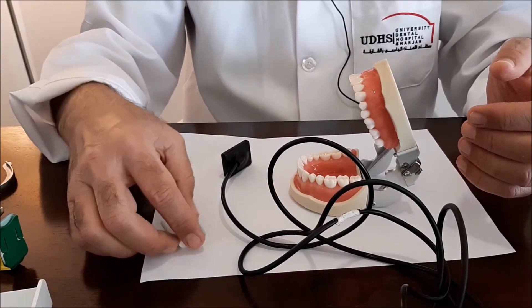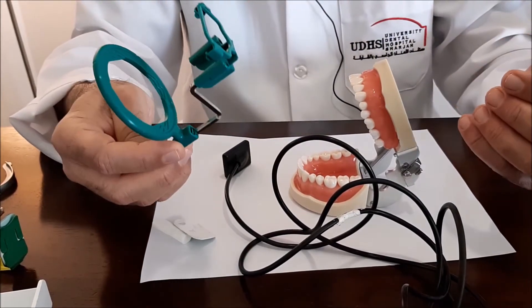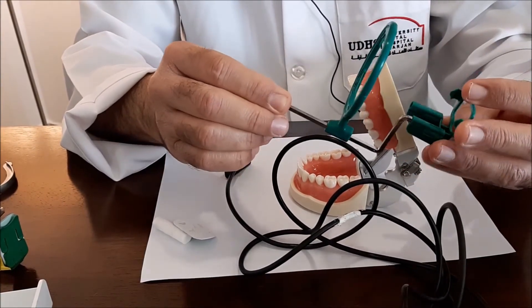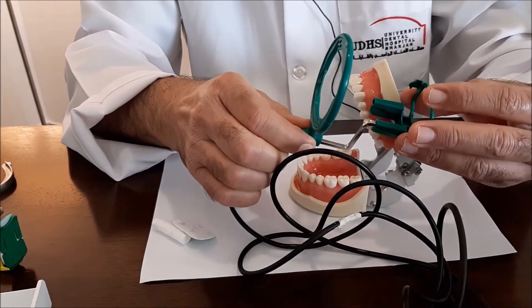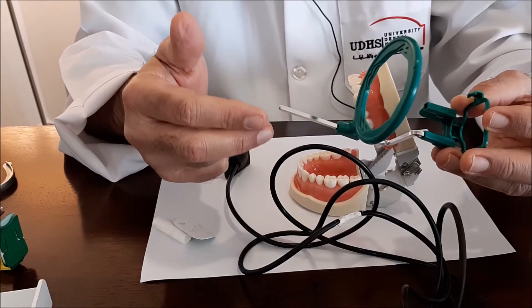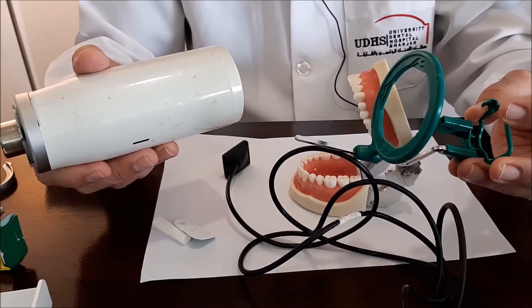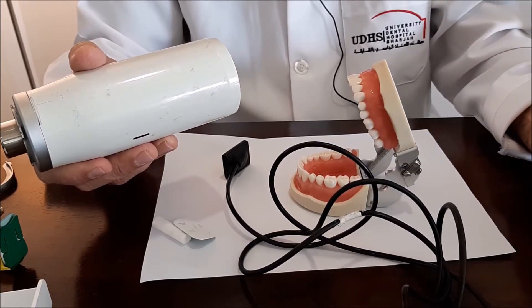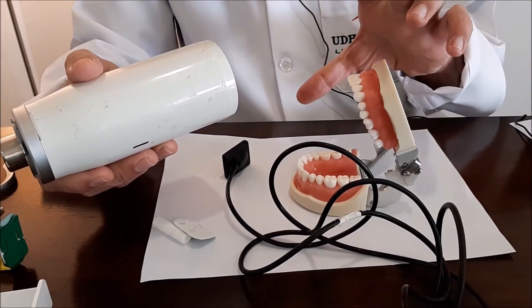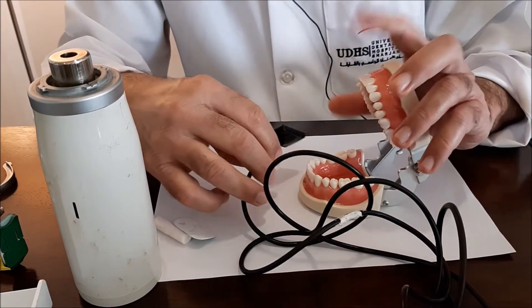Let us start with the central incisors. We will start without the use of a sensor holder — that is what we call the bisecting angle technique. The bisecting angle technique is easier to place because you are not going to use those bulky sensor holders. However, there is a great chance of elongation and shortening of the image because you have to calculate the angulation of the x-ray beam. From what we have seen, in about 95% of cases the images will appear longer and you will fail to capture the apex of the tooth.